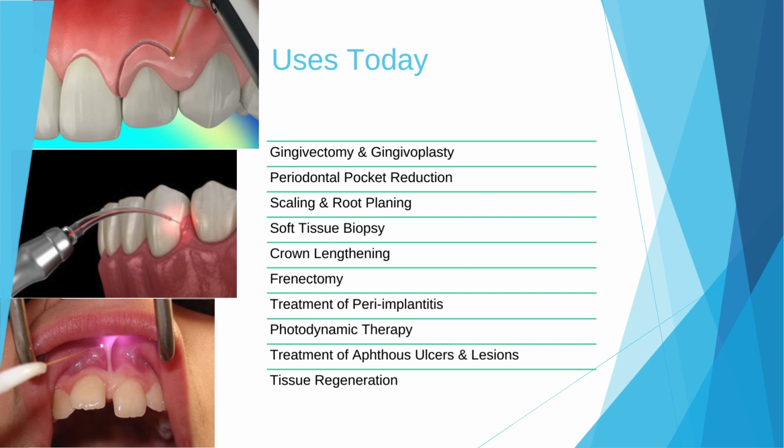Photodynamic therapy, the application of lasers in combination with a photosensitizing substance. The antibacterial properties of this approach, which targets and eradicates microorganisms linked to periodontal disorders, are being investigated.